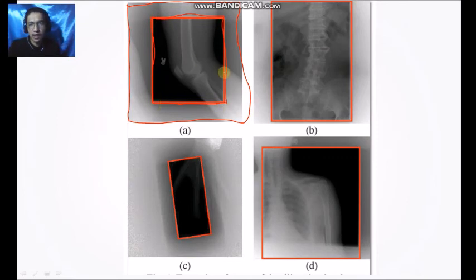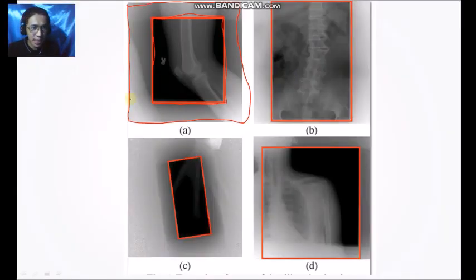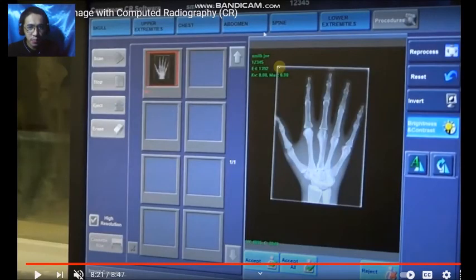So, for example, in this part, not the whole of the imaging plate has been displayed. That means this is absent. This gray part has been absent. So only the collimated part is present on the radiograph, on the monitor. That means the computer has recognized the exposure field.